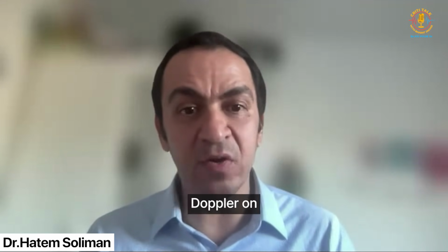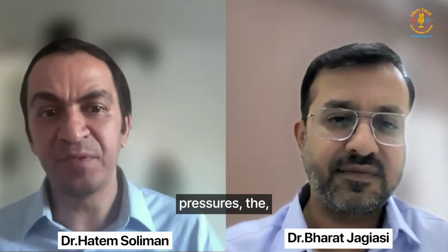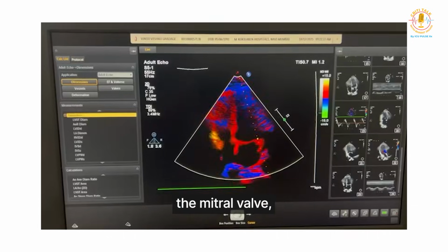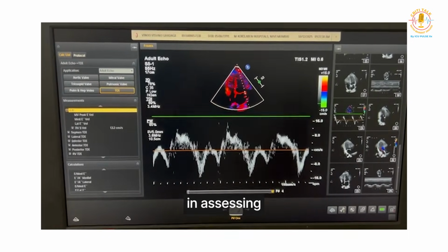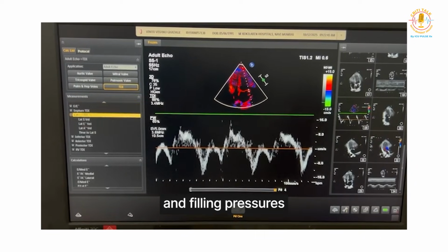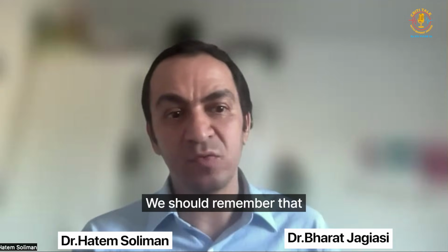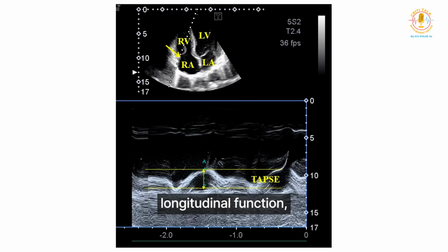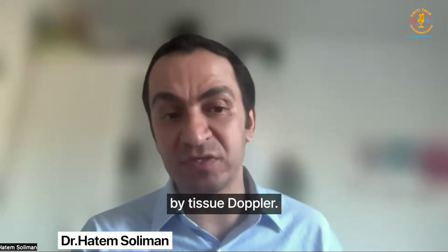Now we have tissue Doppler on handheld devices, which can very quickly evaluate the filling pressures, the annular motion of the tricuspid valve and the mitral valve, which is really important and fundamental in assessing the filling pressures on the right and on the left, and also the longitudinal systolic function on the right and the left. We should remember that the main determinant of RV function is the longitudinal function, which is the TAPSE or the systolic velocity by tissue Doppler.